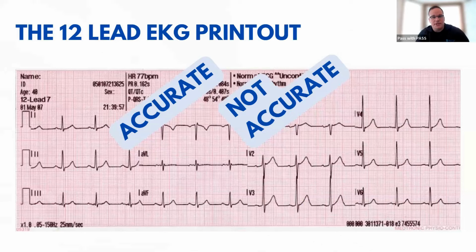understand the pathophysiology of an MI, and accurately determine and identify a STEMI. So the 12-lead EKG printout, and for those of you who have been in our CE program for the full 4 years now, you've seen this every single year, like I already mentioned, and I think it's important to keep it in there because I think it's a common misconception that not for all providers, but there's still some providers out there, and I see them in my full-time position occasionally.